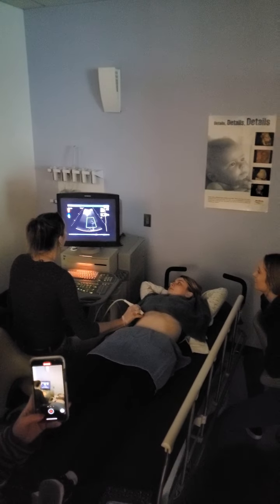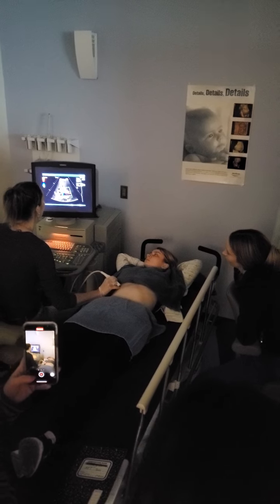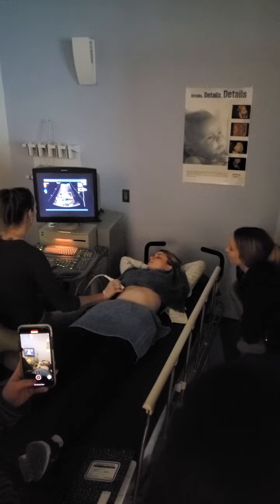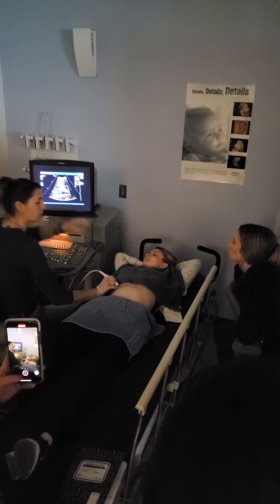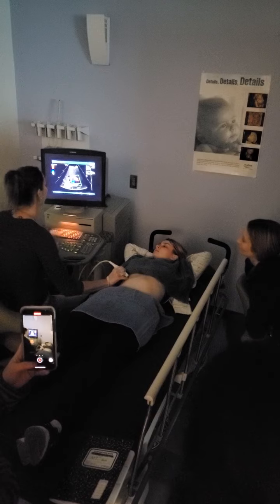So I'll just say to my patients, okay, I've got where I need you, go ahead and hold your breath right where it's at. Kind of twizzle around so I can elongate that out, and there's my color image. How are we feeling about that? Wow. So that's the only one that you guys will need. The measurement and this one are the only ones that you need for your protocol, but I'm going to show you what else we do because you'll get it third quarter.